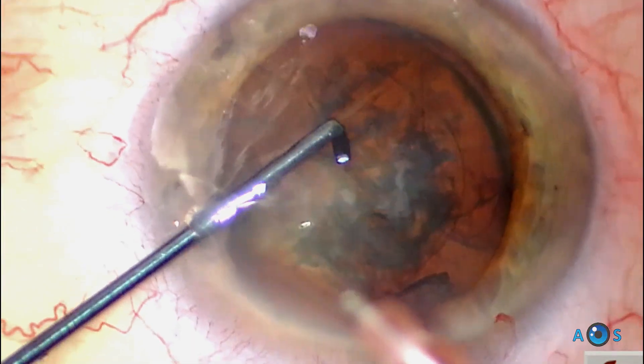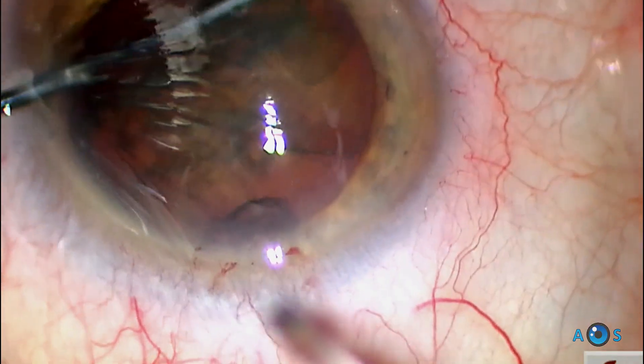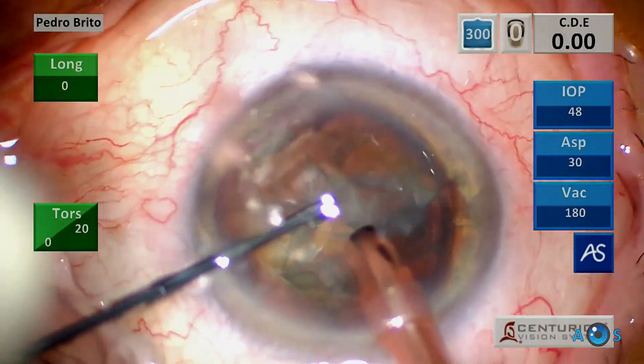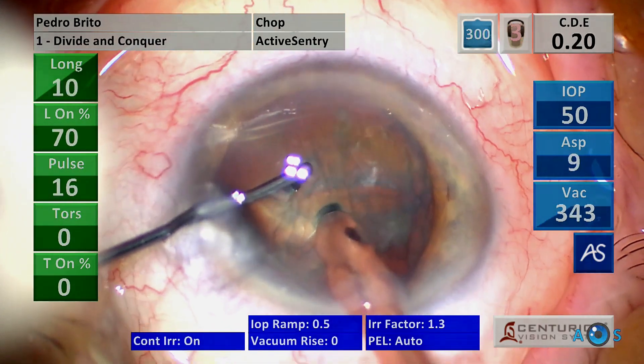This is a Grade II corticonuclear cataract. After capsulorhexis and gentle hydrodissection, the chopper can be used to cleave the corticoepinuclear layers. In a rotational maneuver made popular by Dr. Rosatelli, this leads to a very clean capsular bag, but should be avoided if zonular weakness is observed.